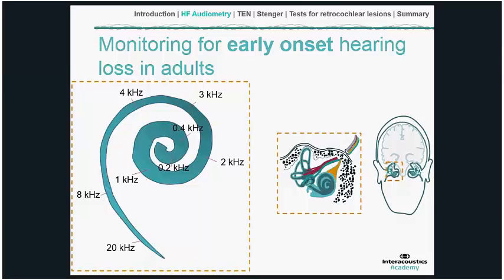But if we just concentrate our attention on the left, then it's clear to see that in the very basal part of the cochlea, and I'll just use the pointer to illustrate where I mean here, the sensitivity of the ear extends quite substantially upwards in frequency terms, beyond the 8 kHz range that we typically test in pure tone audiometry.